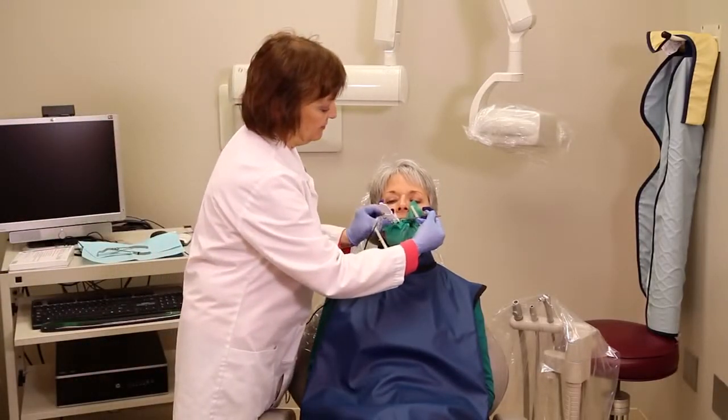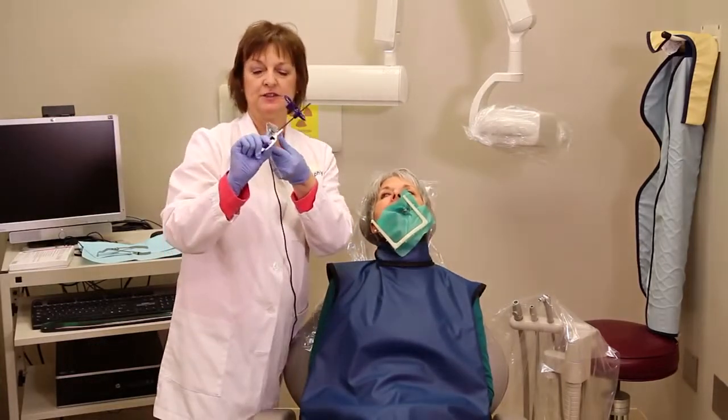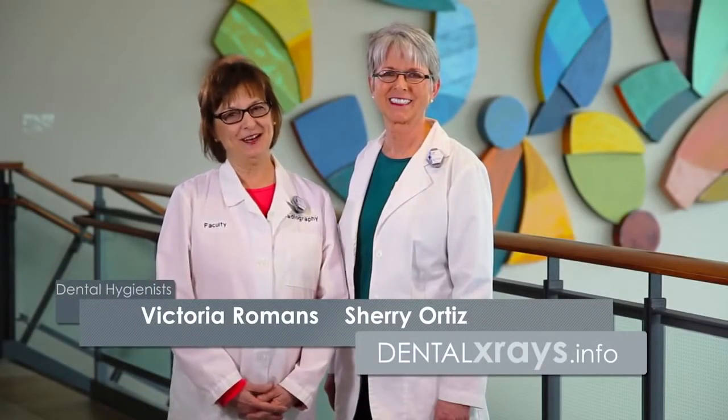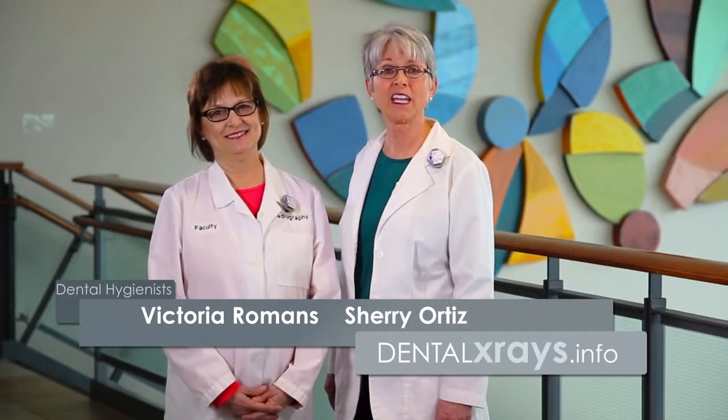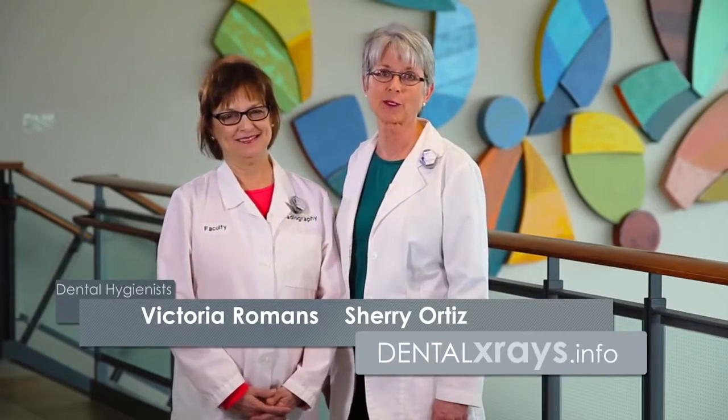When you take it out, this is how it was positioned — so you can see right behind everything. We hope that this demonstration helped you today, and if you have any further questions, visit our website dentalxrays.info and click on Ask the Experts.